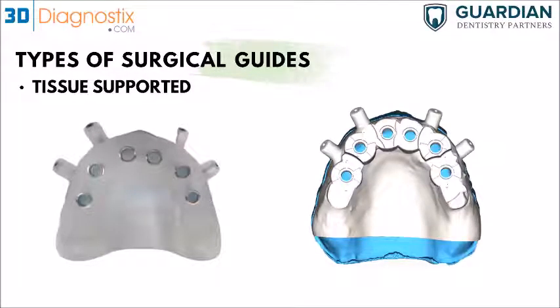This is the design, and this is actually the patient's denture. So what we did is we took the denture and we processed, or we designed, the guide to be a replica of that denture. So right here, this is where the dentition would be basically, but since we've got those guiding sleeves, we had to just create a flat surface for those sleeves.